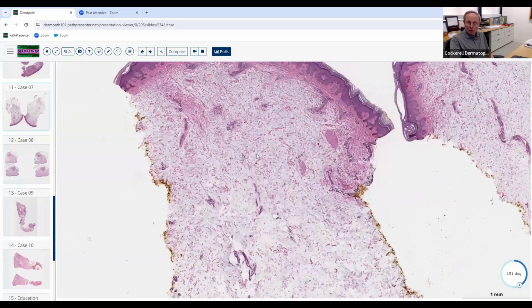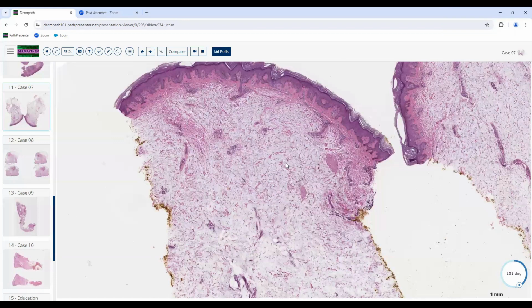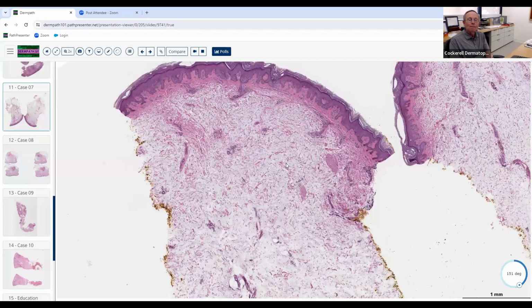Are there any other conditions where you can get massive deposits of mucin like this, other than pretibial myxedema? You know the answer has to be yes, or I wouldn't have asked. I think you could. There's not too many others, though, which is good news. But a couple you should at least know about.